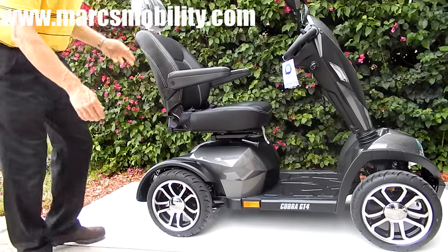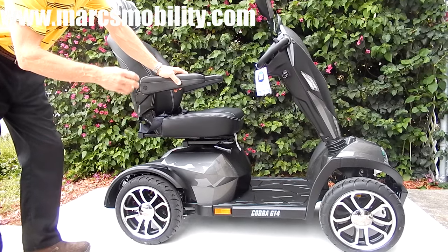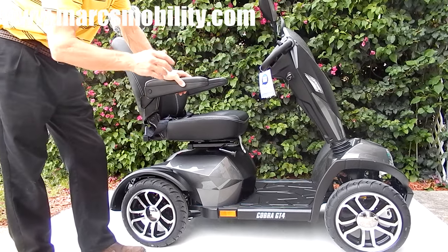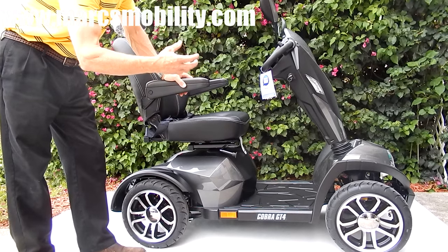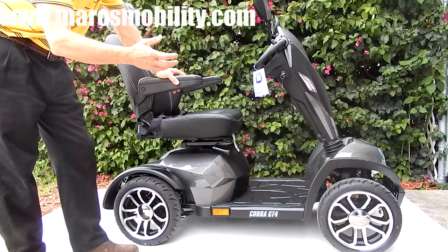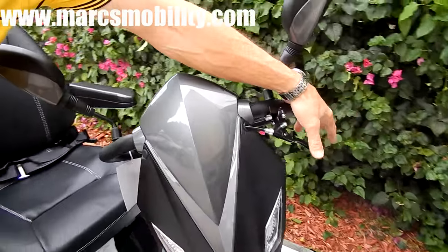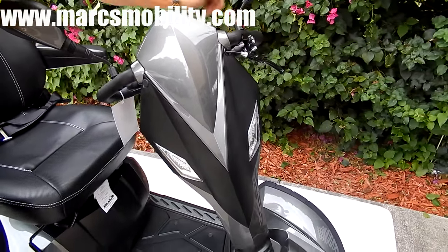This scooter has a 950-watt motor, which is a very powerful motor. It has electromagnetic brakes. What that means is when you let go of the throttle, the scooter will come to a stop within a few feet. There's also a handbrake in the front as a secondary precaution right here — by pushing this, your scooter will stop automatically.